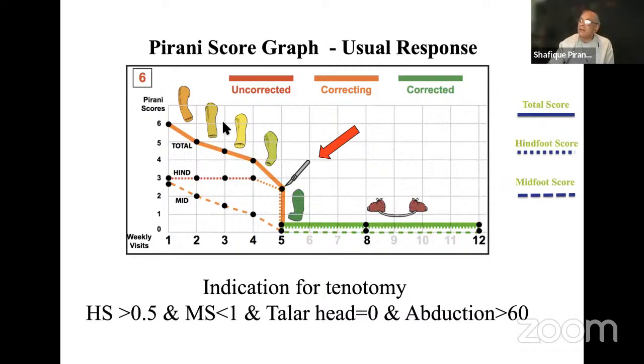Tenotomy performed any earlier will not be effective, because the calcaneus will still, to some extent, be under the talus, and you won't get a full correction.